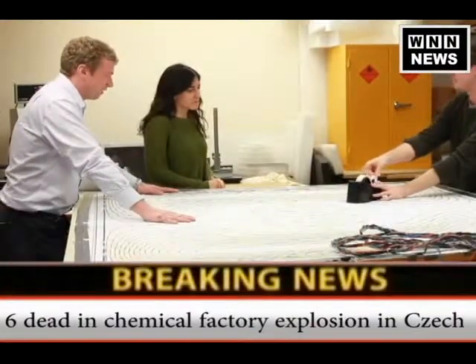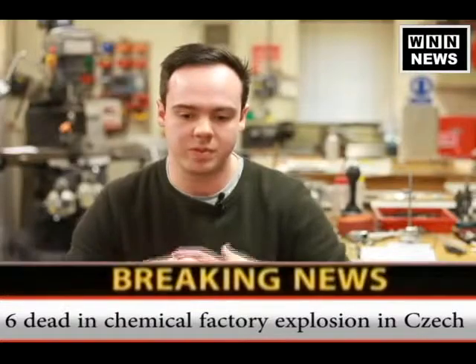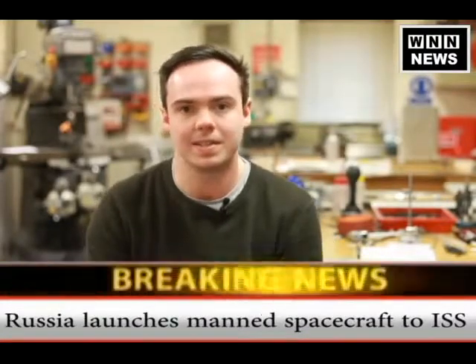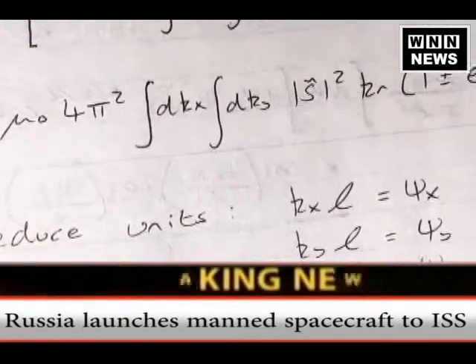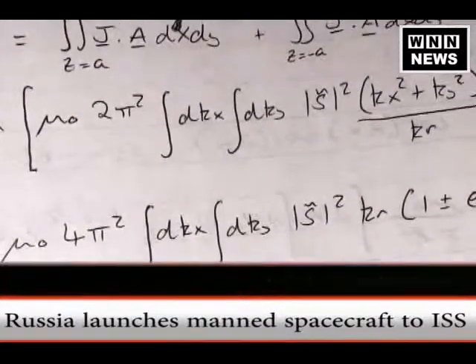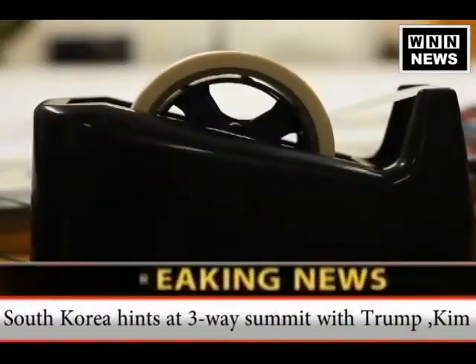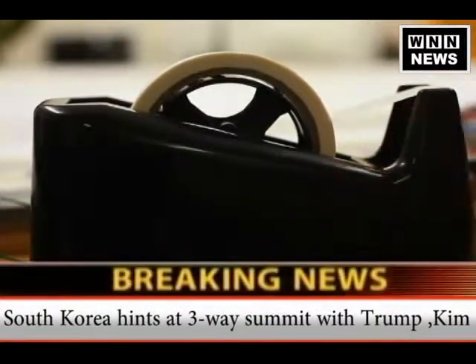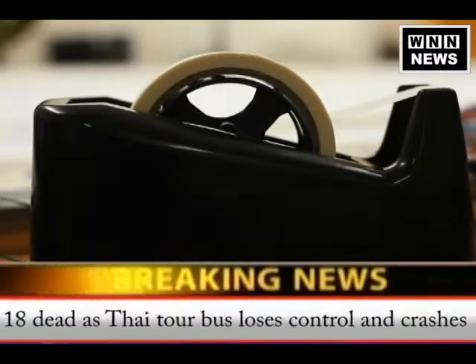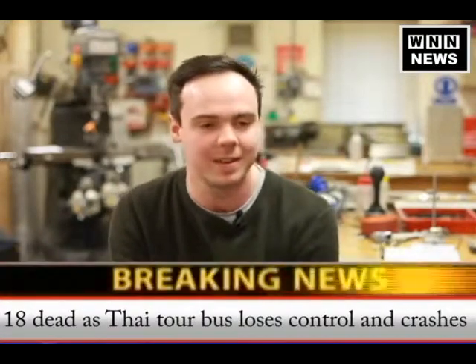The way we went about this was to build these new electromagnetic coils that produce fields that are equal and opposite to the Earth's magnetic field. So the mathematics required to design these coils to reduce the magnetic field is actually quite complex. It's quite a large challenge, but then once you've got past all of that, the actual making of the coils is bits of wood, bits of masking tape, bits of glue and bits of wire, so it's a massive contrast really in what you're doing.